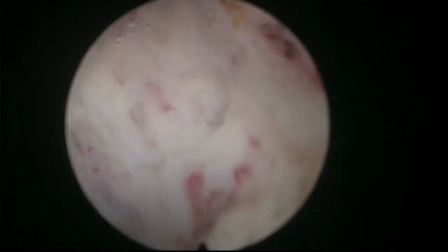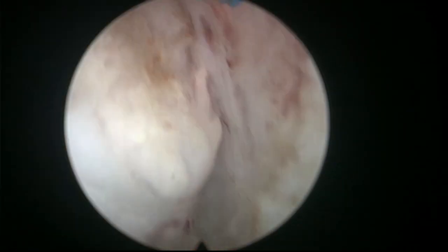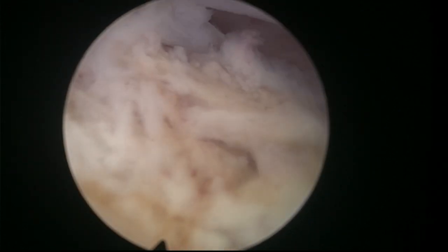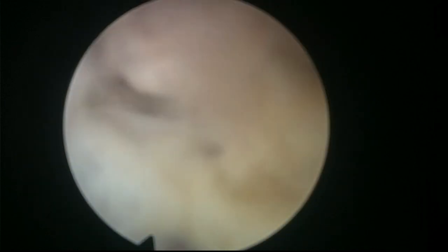Okay, so here I'm having a little bit of trouble, let's say, connecting both sides. There must be some tissue up here that I'm not able to cut for the moment. So here you have to be patient. As long as we are in the white region, you see, we are in the white region, so it's safe. The sphincter is way back.